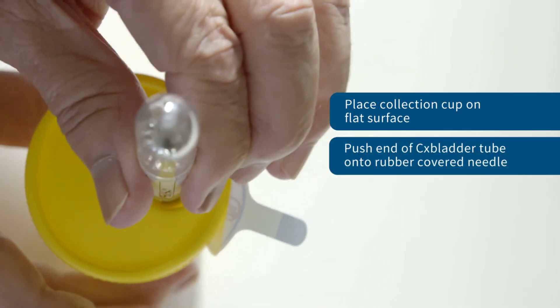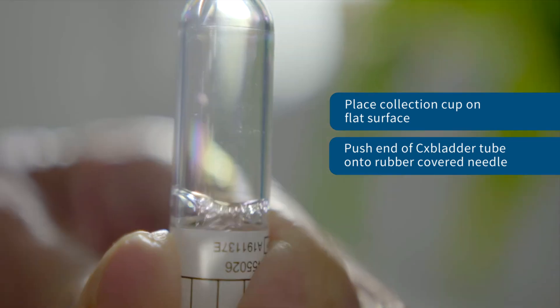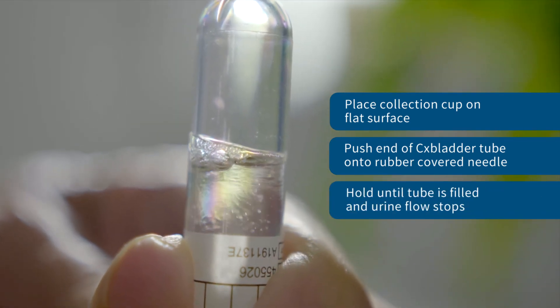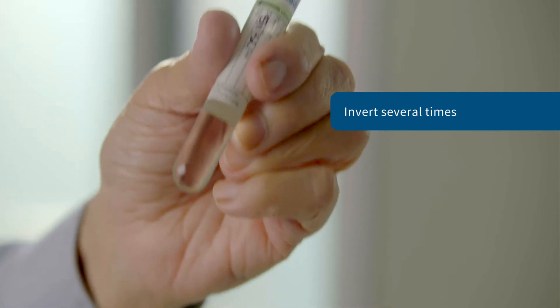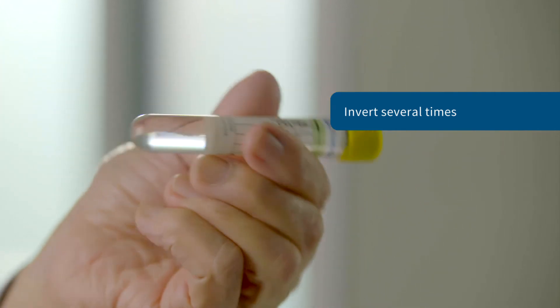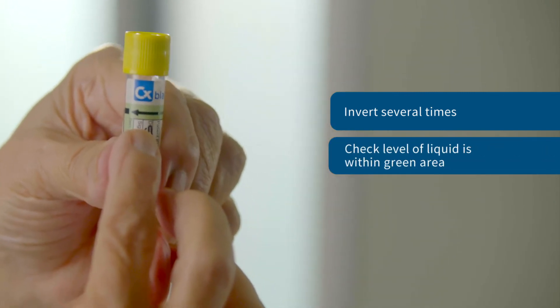Push the yellow cap end of the CX Bladder tube onto the rubber-covered needle firmly to begin the flow of urine, and hold in position for approximately 20 seconds or until the flow of urine into the tube stops. Remove the tube and invert gently 2–3 times to mix the urine sample with the CX Bladder liquid. Hold the tube with the yellow cap upward and check that the level of liquid is within the green shaded area.